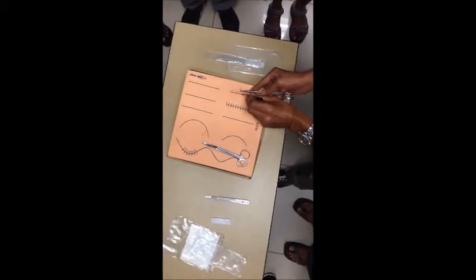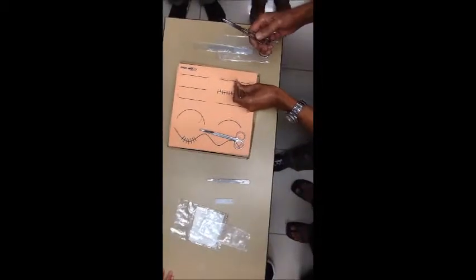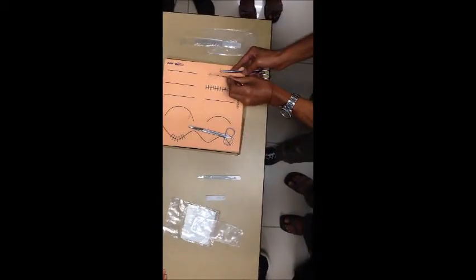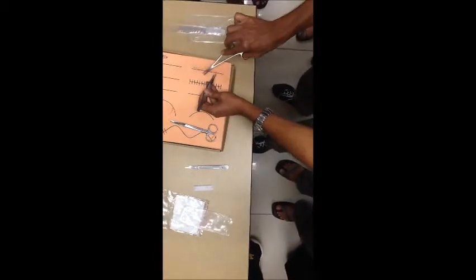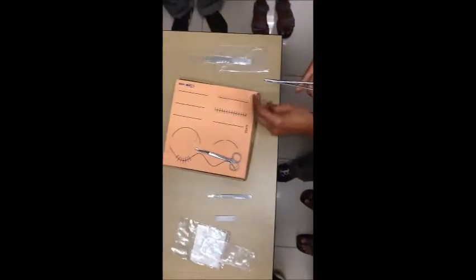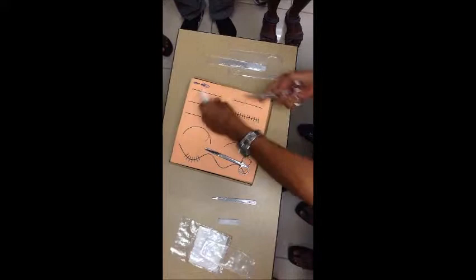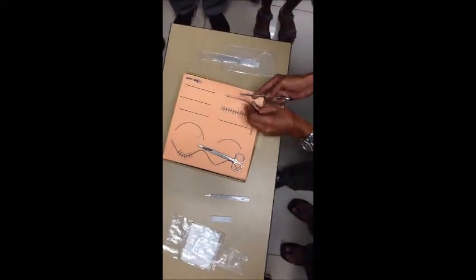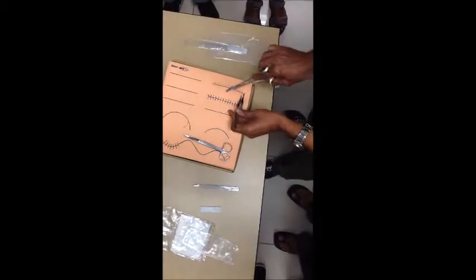Next bite. There we go. Next. The stitches should be almost evenly spaced out, and they should be roughly parallel with each other. When you reach the end, I'll show you how to finish the knot. That is a little tricky, so let me continue till we reach the end.